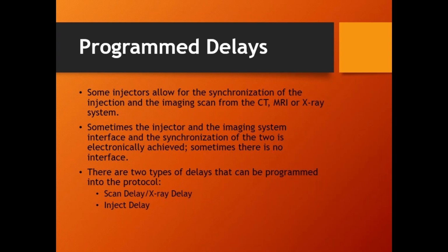I'm just getting into the specifics of the Stellan. There's a 700 box, an 800 box, and a 900 box. And the box that you need is dependent upon the manufacturer of the imaging system. Like, and these aren't real, but I'm making these up, GE needs the 700 box, Siemens needs the 800 box, and so forth.